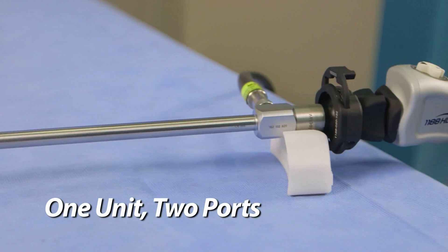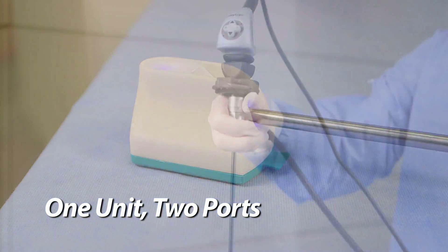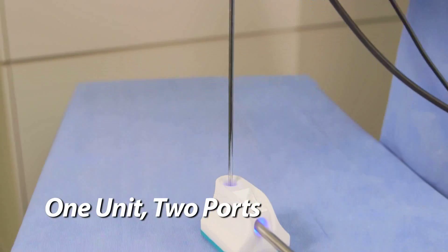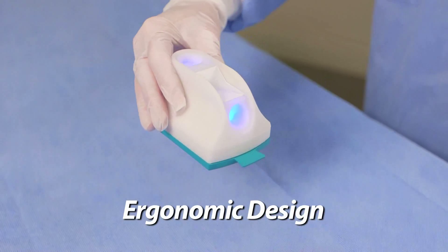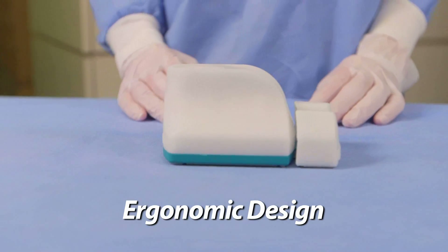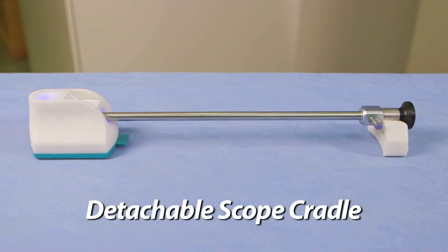Both ports can accommodate scopes ranging in size from 3 to 12 millimeters, eliminating the need for a port-sized converter. Additionally, both ports can be used simultaneously during surgery, providing greater efficiency and reducing surgery delays. Built-in LED lights allow for enhanced port visibility. The ergonomic design features a contoured, easy-grip profile and stable base which prevents tipping. The detachable scope cradle safely and securely supports the scope, reducing tension on the lens and potential for damage.